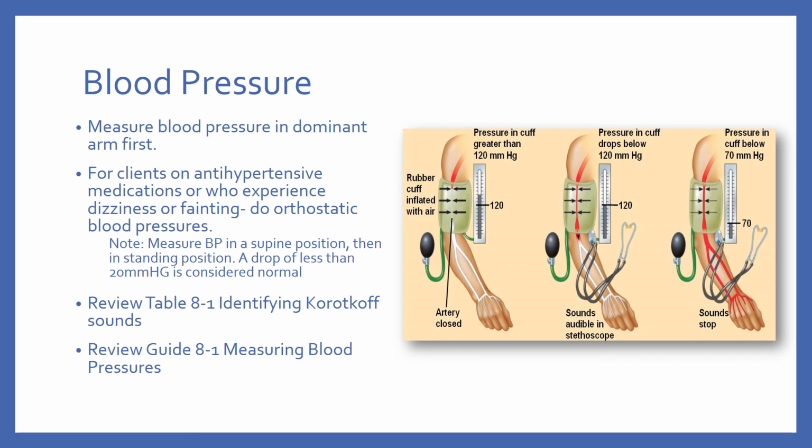The level at which you first hear faint but clear and consistent heartbeats is the systolic blood pressure. This is phase 1 of the Korotkoff sounds. Continue to lower the pressure until the sounds muffle and disappear. This will be the diastolic pressure in phase 4 of the Korotkoff sounds. Finally, note the point at which the sound subsides completely. This is phase 5 of the Korotkoff sounds.